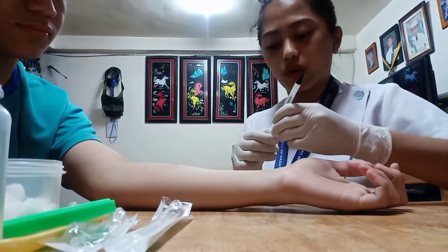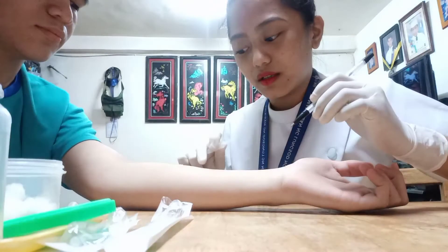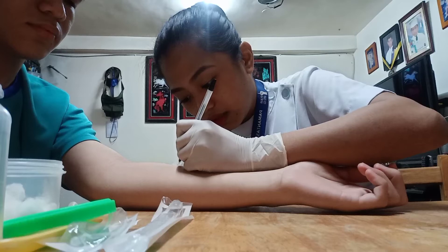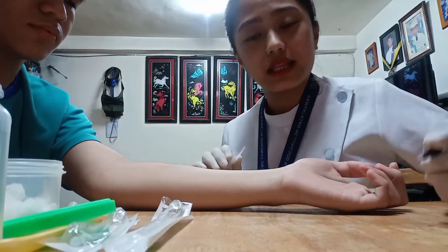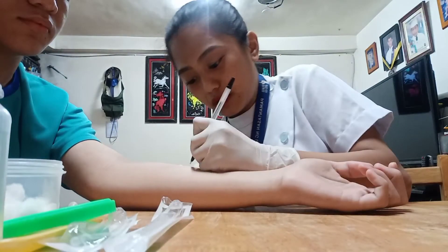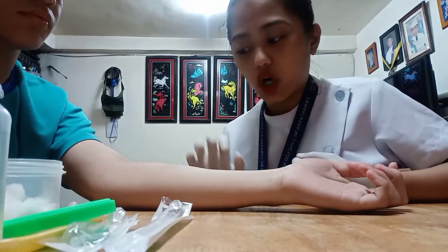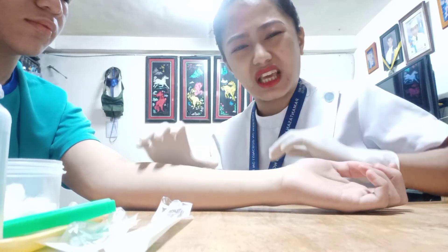After that, I have to draw an outline — encircle the wheal — and then write the time. The current time is 5 o'clock PM, so I will write 5:30 PM. At that time I will need to observe if there are changes on the skin of the patient, such as redness or rashes, which would indicate that the patient has an allergy to the specific medication.